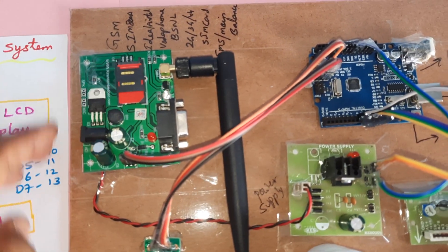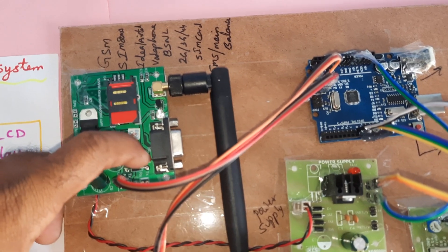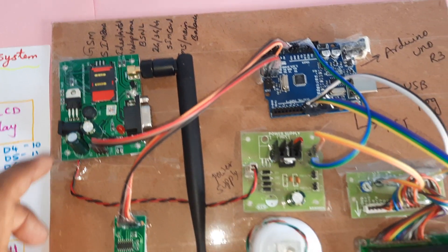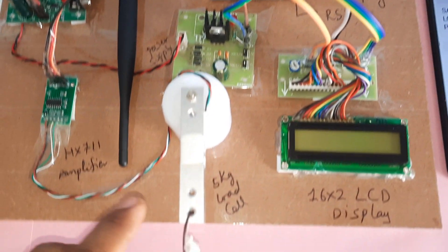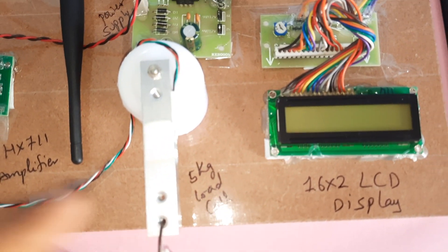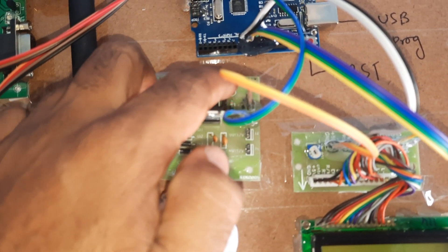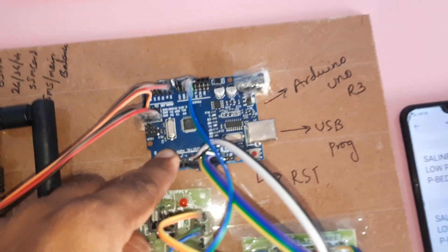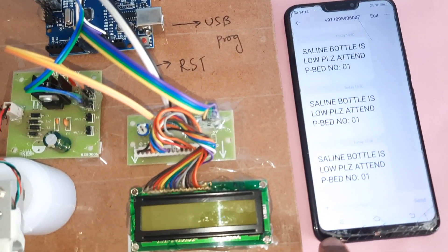Bridge rectifier, filter capacitor, 7805 regulator, one LED — 5 volts power supply board, GSM SIM 800A, HX711 amplifier and 5 kg load cell. Arduino Uno R3 board, one 16x2 LCD display, and we are getting the SMS alert.